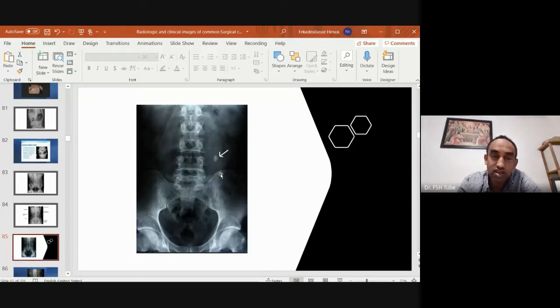Ureter, it looks like ureter because it's very close to the iliac crest. It looks like the ureter, unless it's an undescended or ectopic kidney. The kidney develops in the pelvis, as they ascend up. And then they say horseshoe kidney somewhere in the pelvis, then ectopic kidney, excellent. That's the right terminology. Thank you, Mary.